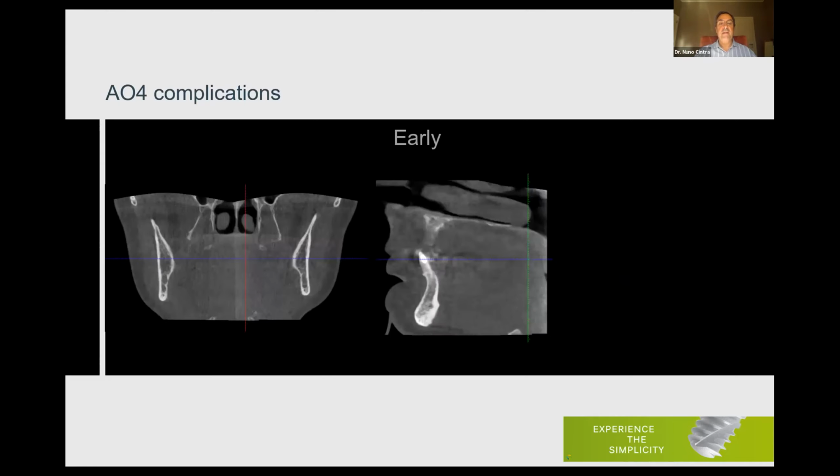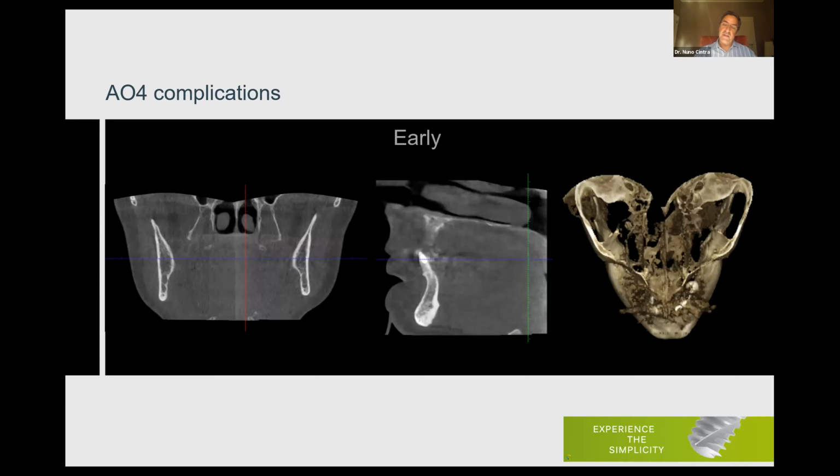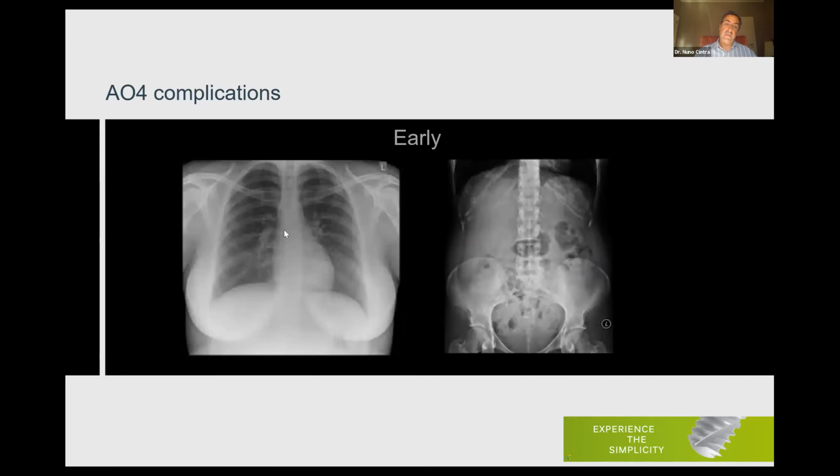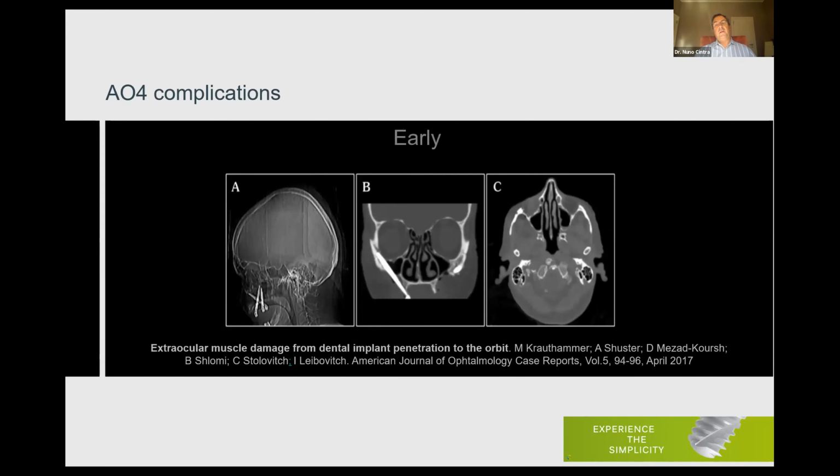And on the day of surgery, we took another CBCT before surgery, and the implant was not there. Luckily, the implant was not there. So we checked the surrounding structures to see if the implant was on any surrounding structure. It was not. So we concluded that the implant was either aspirated or swallowed. As you know, when we think about it, we have to do a chest X-ray. The most probable position will be on the right side due to the vertical anatomy of the right bronchi. And of course, an abdominal X-ray to see if the implant was able to overcome all the curves and twists of the abdominal cavity. And everything was clean. So we were lucky that the patient either swallowed the implant.